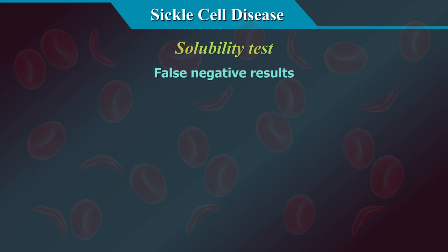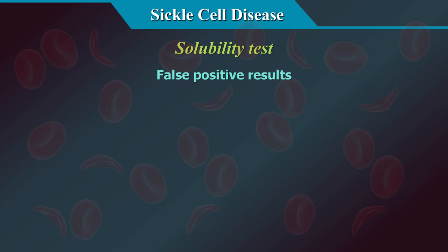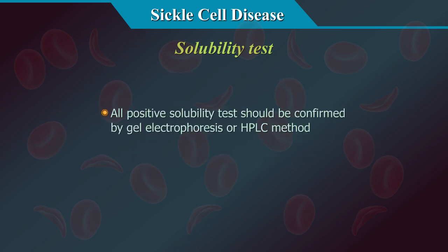False negative results can be seen with blood with low haemoglobin levels, and in infants less than 6 months of age with sickle cell disease when HbS levels are less than 20%. False positive results can be seen in severe leukocytosis, hyperproteinaemia (e.g. multiple myeloma), and in the presence of unstable haemoglobin variants. All positive sickle test cases should be confirmed by gel electrophoresis or HPLC.